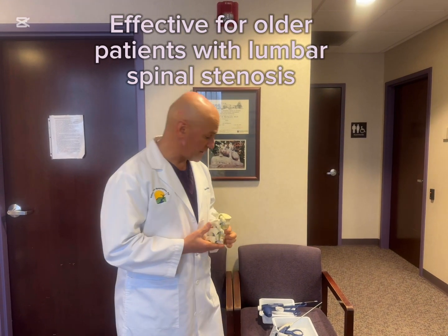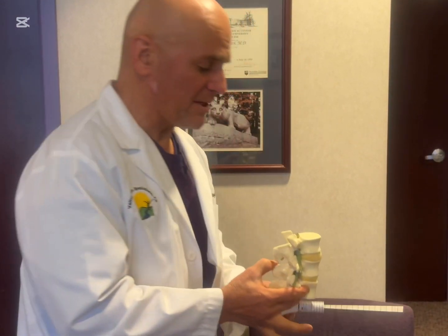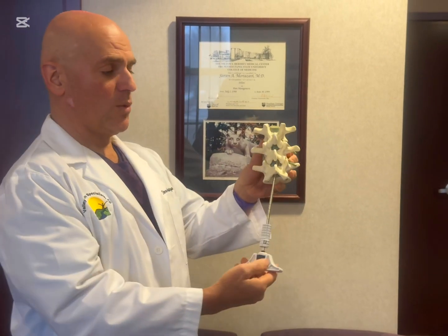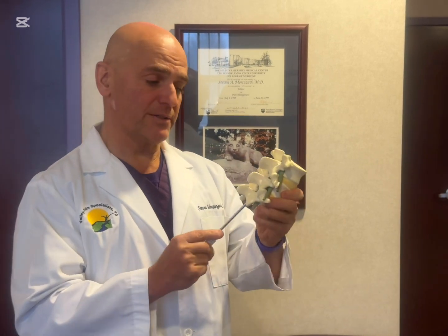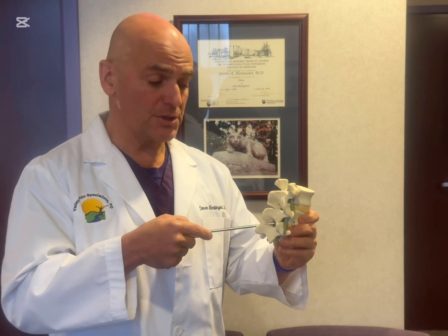So if you look at this model — in a normal spine there should be plenty of room in the canal right here where the nerves are passing. In a patient with spinal stenosis I wouldn't be able to slide this object, this trocar, in this area. There's a narrowing and the nerves are pinched at this level.